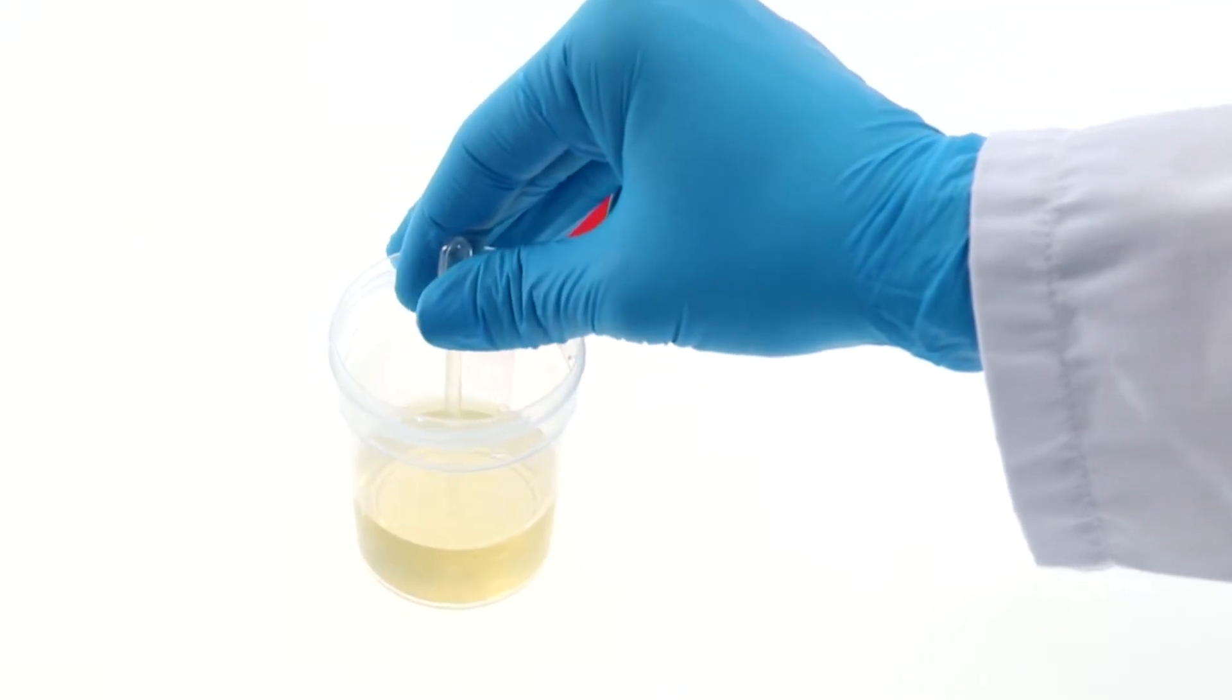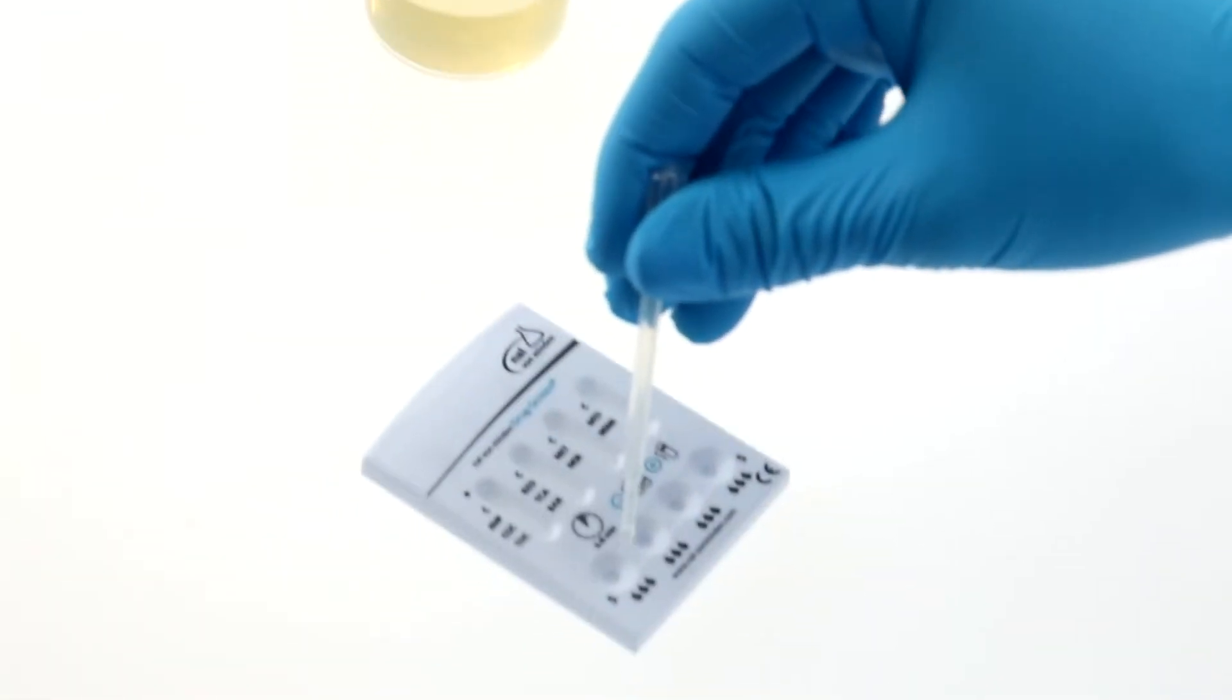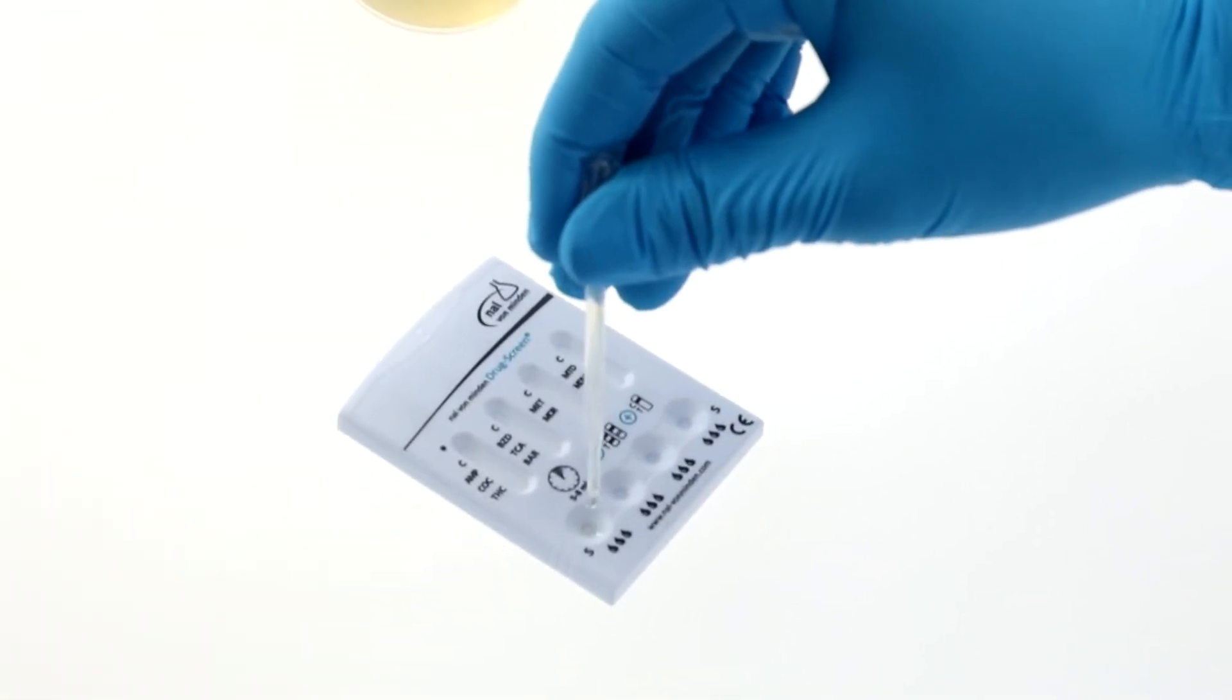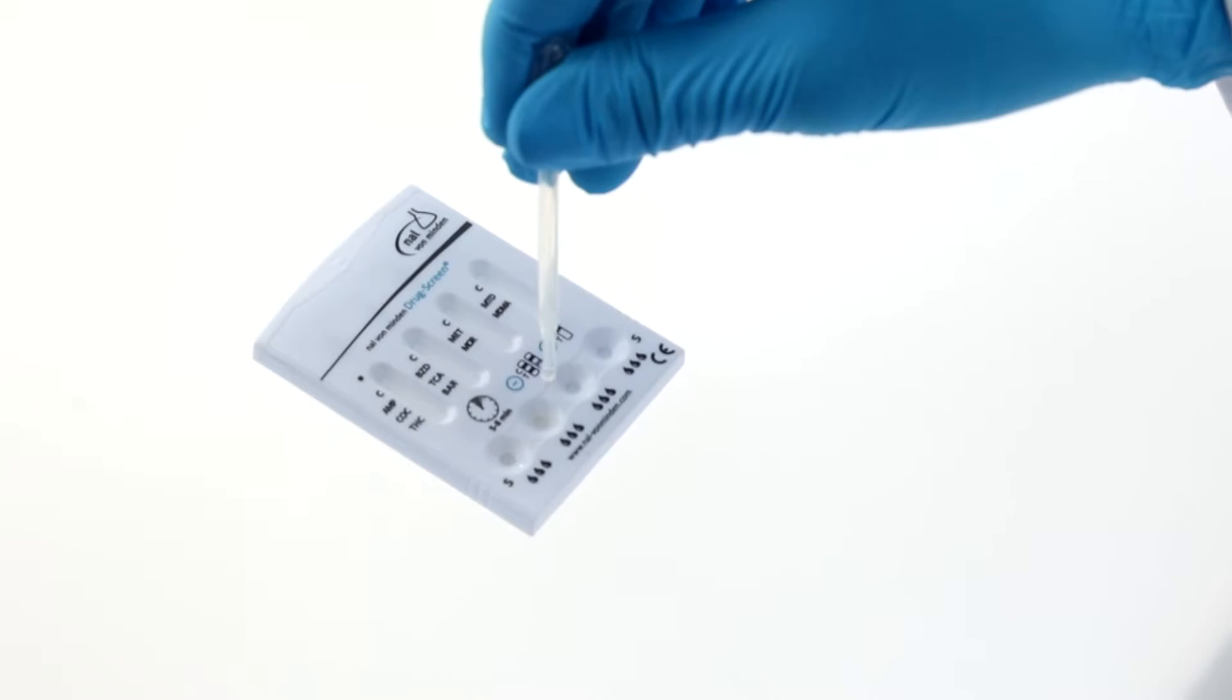Dispense three drops of urine into each sample well of the test cassette. Make sure the urine does not come into contact with other areas of the test.